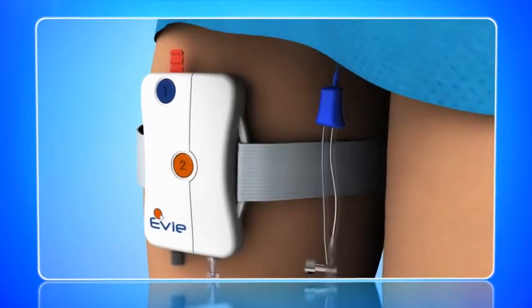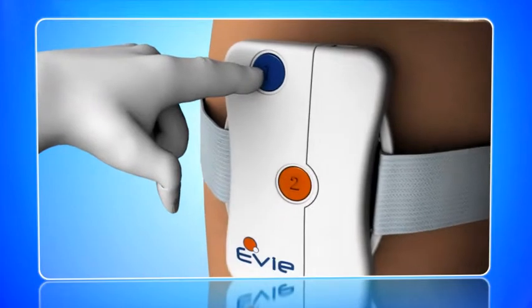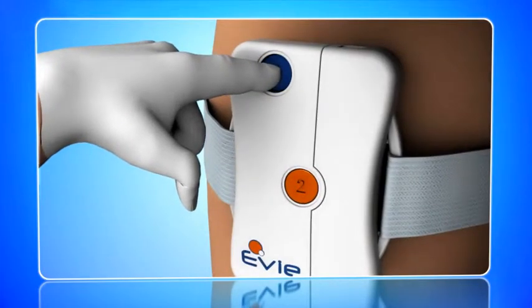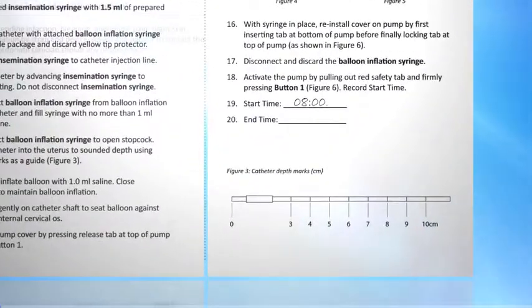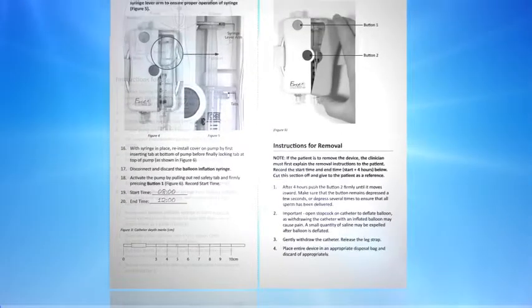Activate the device by pulling out the red safety tab and firmly pressing button number 1. Record the start time on the patient's instructions for removal and give to the patient. Instruct the patient to follow the removal guidelines as follows.